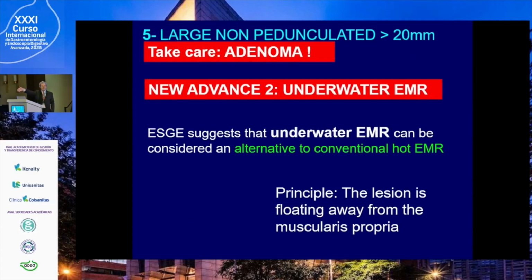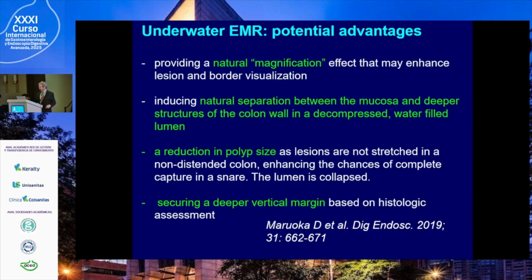Now, underwater EMR, perfectly demonstrated by Sebastian. So ESGE suggests that underwater EMR can be considered as an alternative to conventional EMR, okay? The principle is that the lesion is floating away from the muscularis propria. So you perfectly demonstrated this. And there are other advantages.